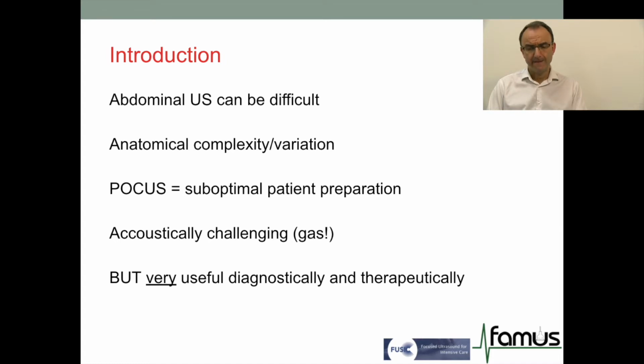Then there are the suboptimal conditions where the clinician caring for the acutely unwell patient can operate, particularly a patient that is not ideally fasting, a patient who can have conditions that increase the amount of gas in the abdomen, and we know that gas is a physical barrier to the penetration of the ultrasound beam.